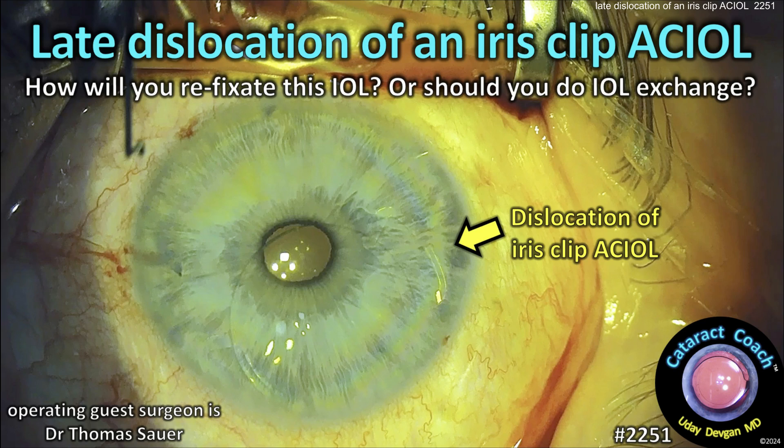CataractCoach.com. Late dislocation of an iris clip AC IOL. How will you refixate this IOL, or should you do an IOL exchange?